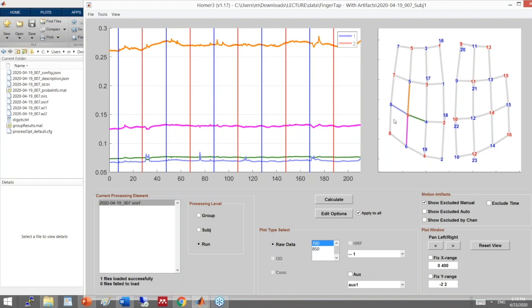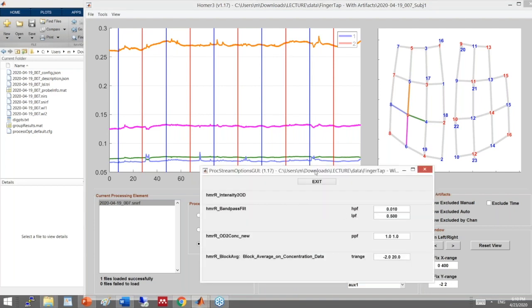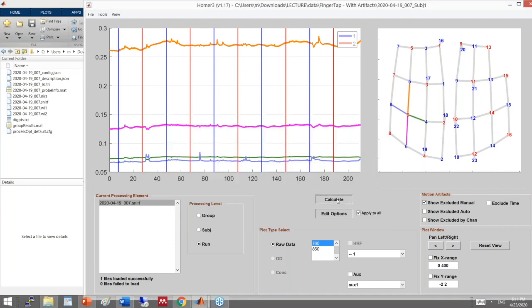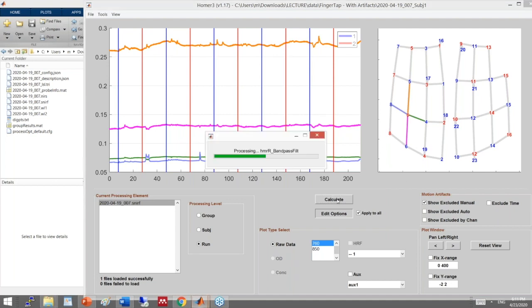I will change the window to 30 seconds since the stimulation was 20 seconds and I want to give another 10 seconds for the HRF to come down. I will run this to verify everything works, then go to 'edit processing stream' to add motion correction algorithms and test each of them.